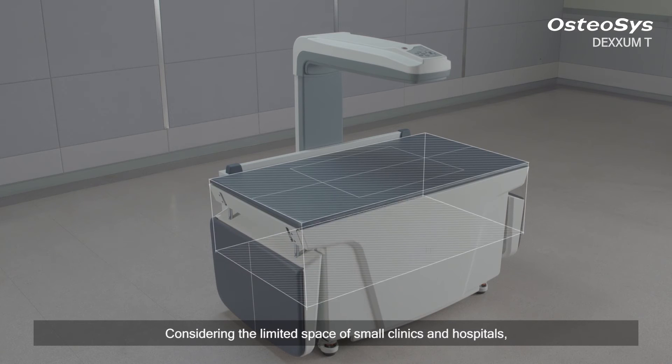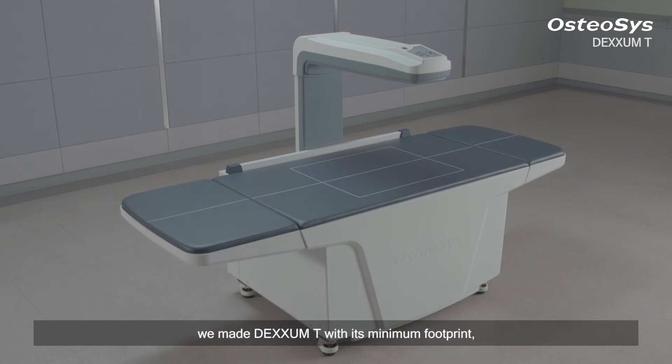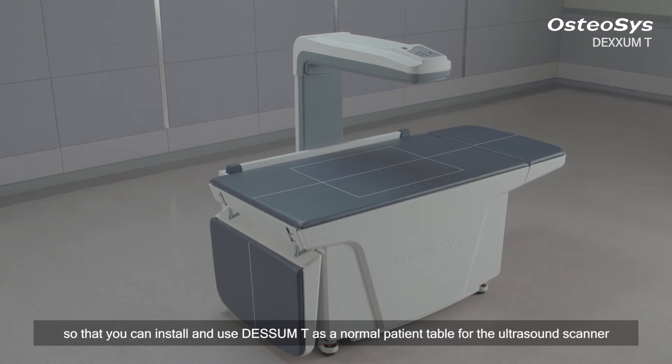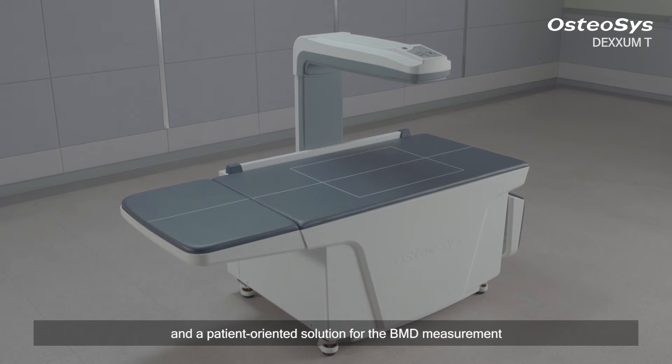Considering the limited space of small clinics and hospitals, we made DEXXUM T with its minimum footprint so that you can install and use DEXXUM T as a normal patient table for the ultrasound scanner. The tri-fold type table is an operator-friendly and patient-oriented solution for BMD measurement.